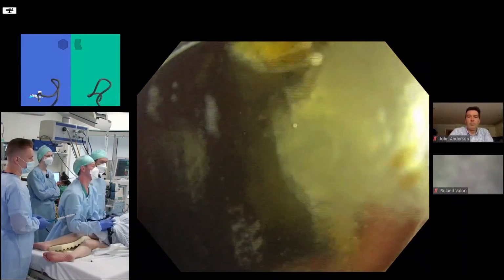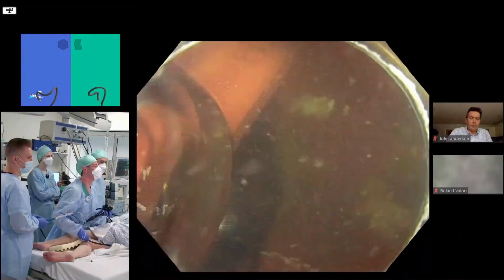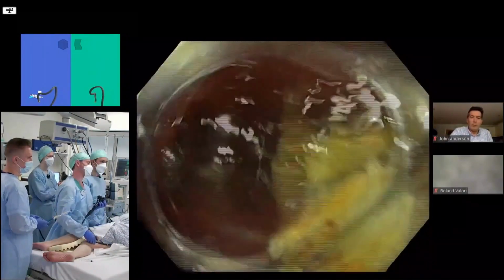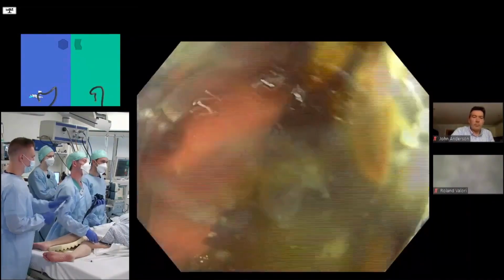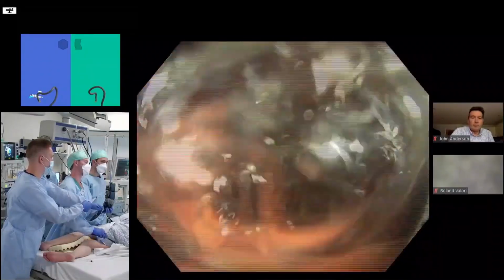The English are looking at the scope guide and almost as good as on mute and maybe not watching. More injection? Probably not. Yeah.